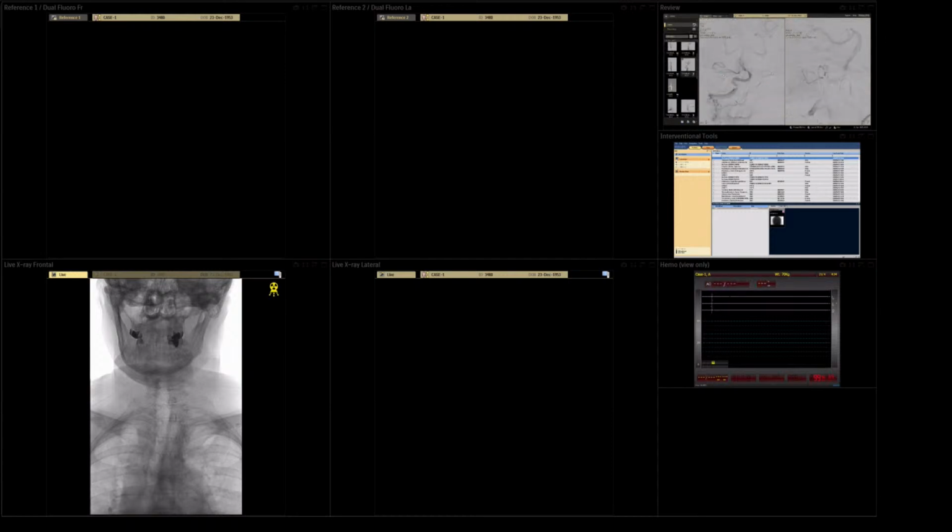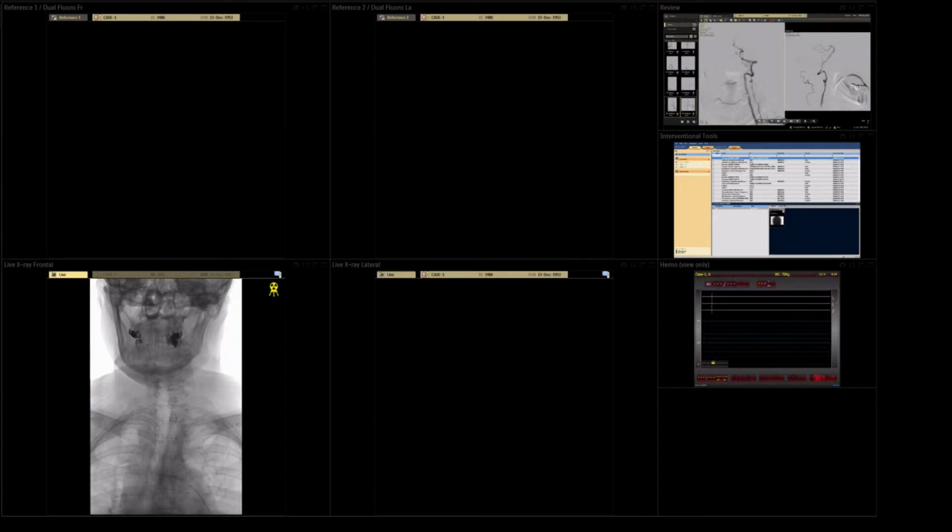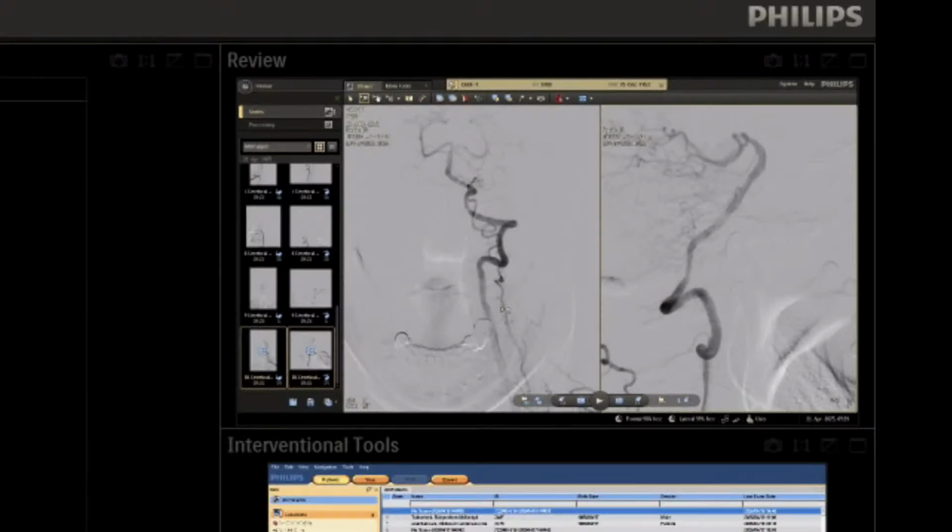Okay, let's check the PCOM. On right side there is no PCOM, and now Dawlet made angiography on the left side. The left vertebral artery orifice was also stenotic. V3 segment stenotic, and V4 segment is also stenotic. Here the distal basilar looks normal. I think it was no, this segment is stenotic. But here it's all okay, no problem.